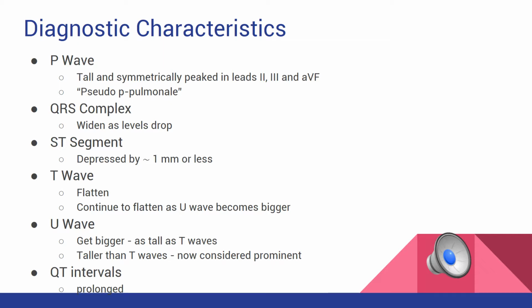QT intervals will often also be prolonged. But the major things that we're going to notice here are these tall peaked P waves and the presence and enlargement of the U waves.